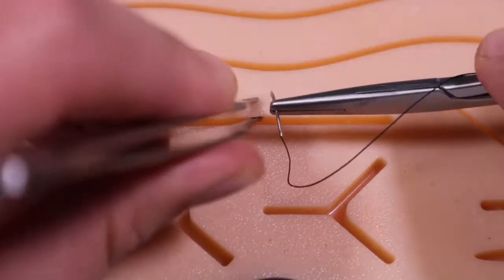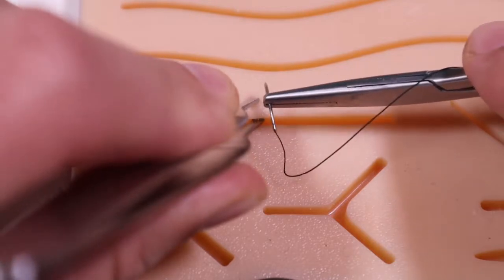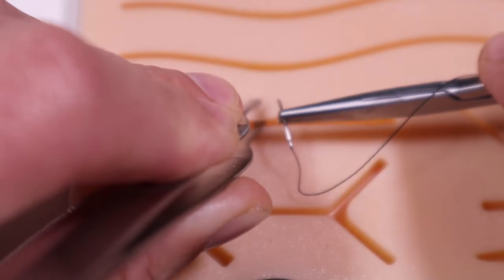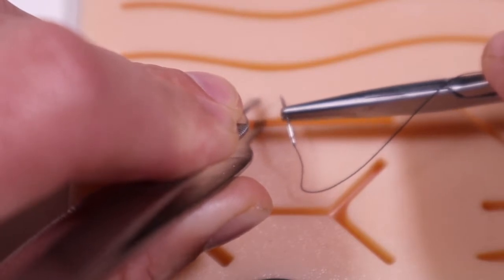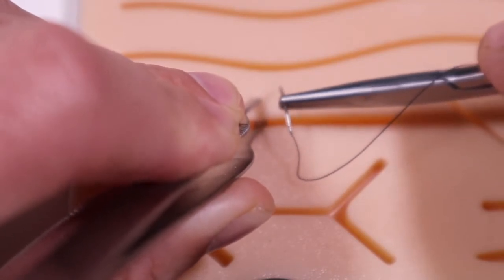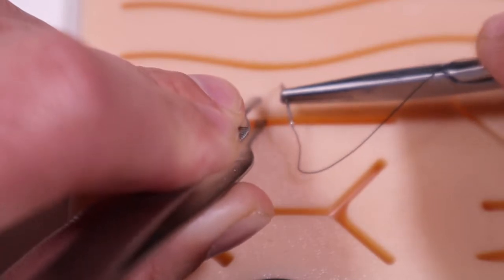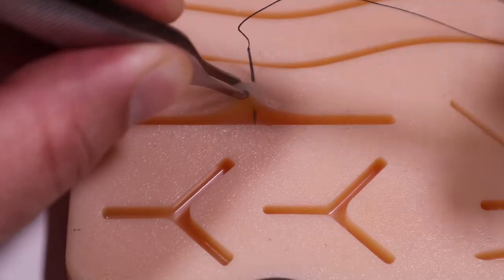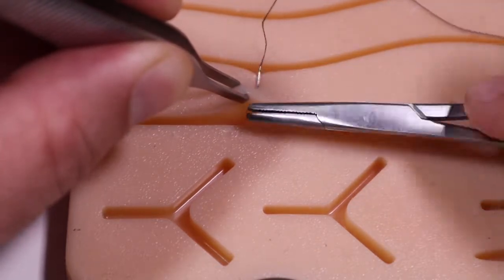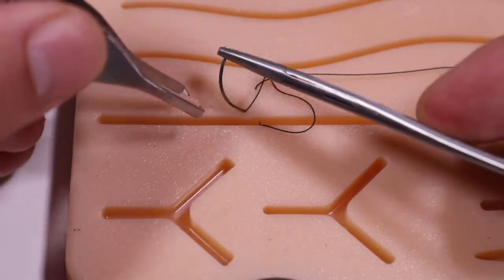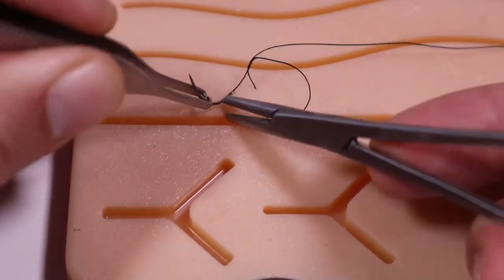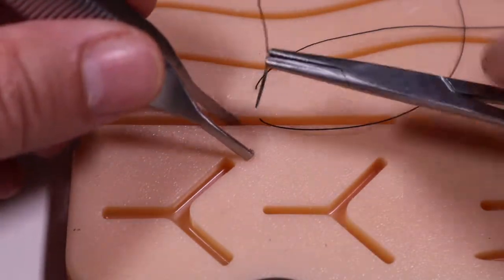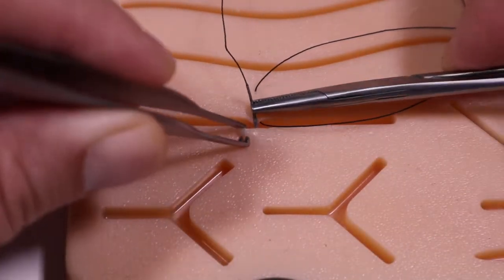Just as we do in the interrupted suture technique, we're going to start in the middle. Now with the simple interrupted, we start about five millimeters from the wound edge. We're going to roughly double that. We're going to come out the wound edge.